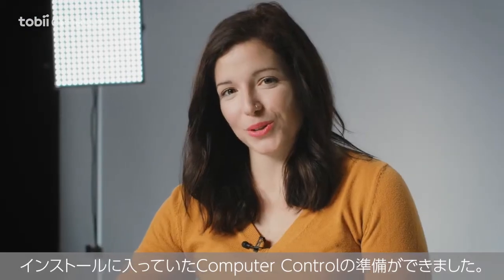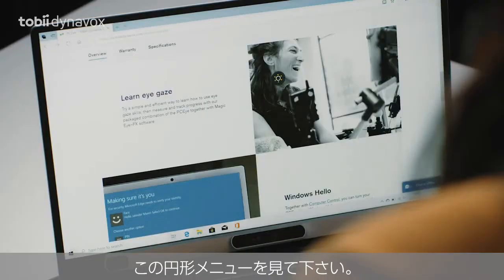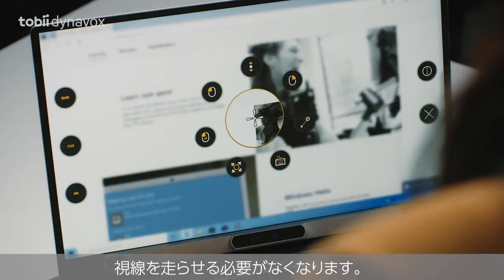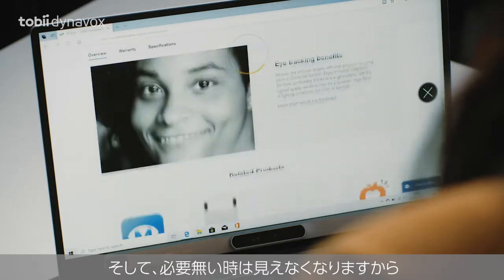Once you've installed computer control, which is included, you are ready to go. Notice this circular menu. This means that your eyes don't have to travel all the way to the edge of the screen to interact. And it disappears when you don't need it, which gives you more space.